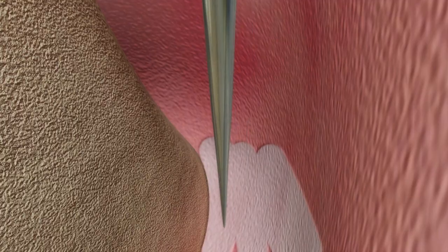An endodontic explorer is used to confirm that all soft tissue has been removed from the bone so we get great regenerative factors coming from the bone.